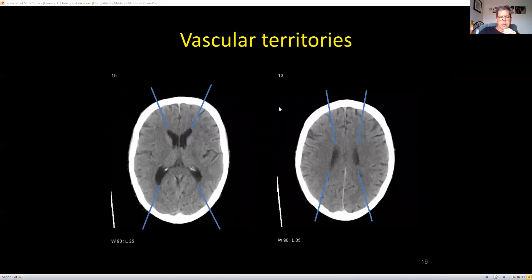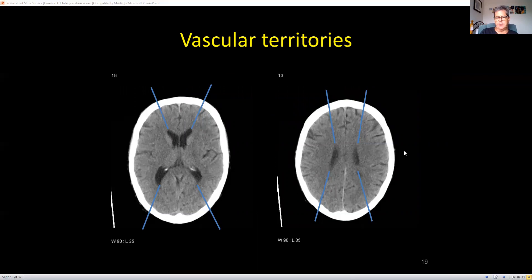You need to know a bit about the vascular territories — relatively simple. These are two cuts of the CT scanner. At the front is the anterior cerebral artery territory. Then of course the very commonly involved middle cerebral artery territory. And at the back is the posterior cerebral artery territory.